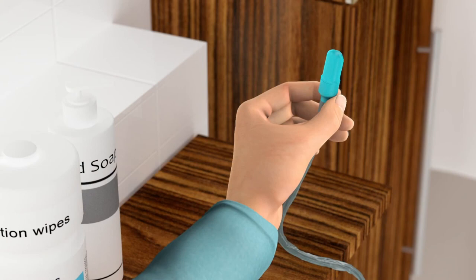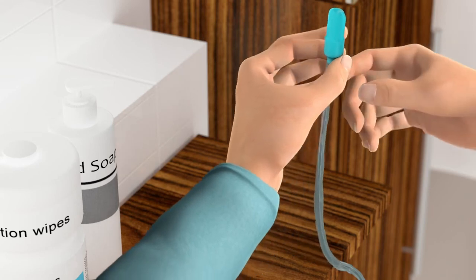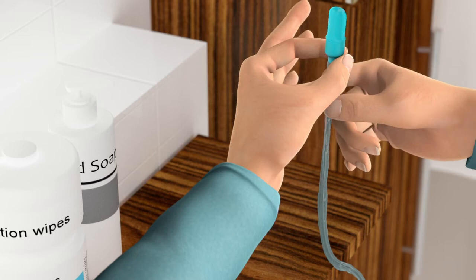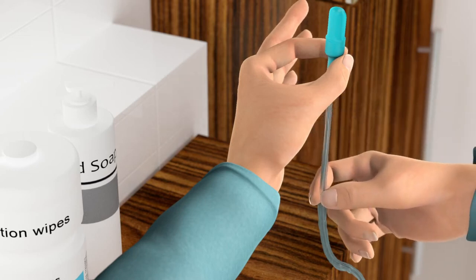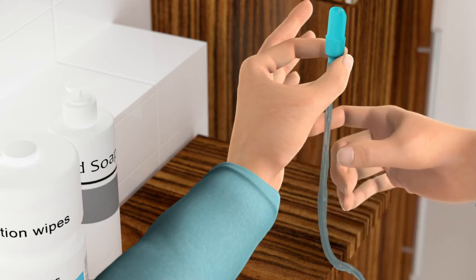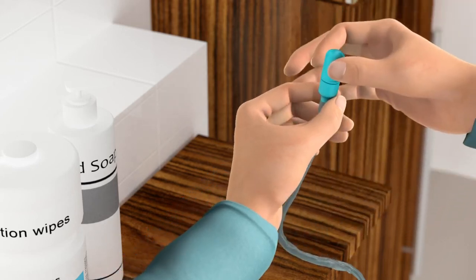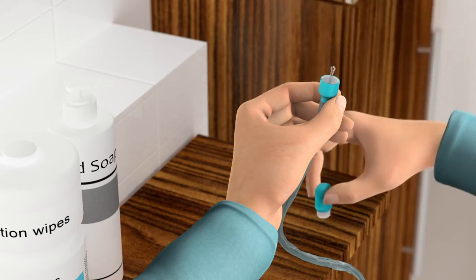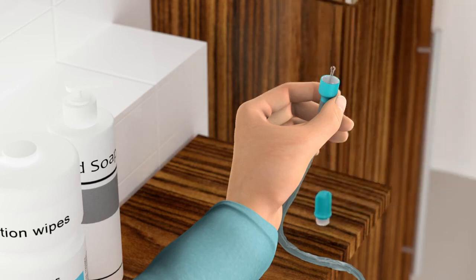Now you must drain the liquid inside the sleeve into the bag. This is to prevent liquid from leaking from the other end of the catheter. Hold the end of the catheter upwards. Gravity will then empty the liquid into the bag. Glide your fingers towards the bag to make sure all liquid drains into the bag. Twist the turquoise cap counterclockwise to release it from the catheter. Save the cap for disposing of the catheter.